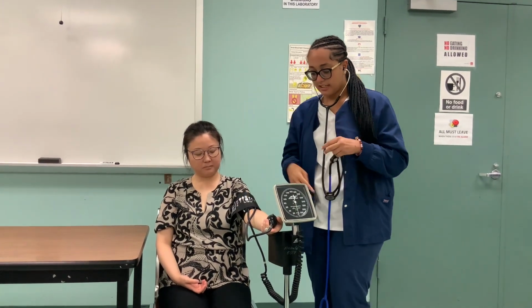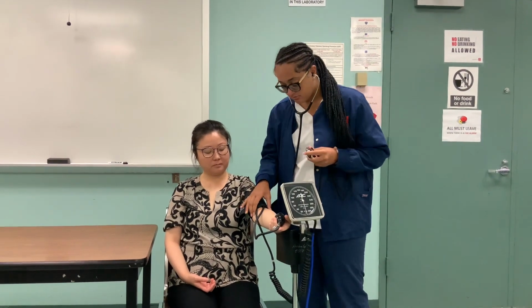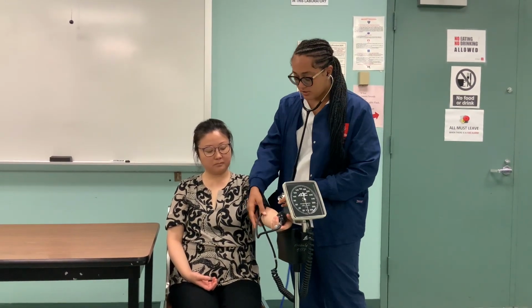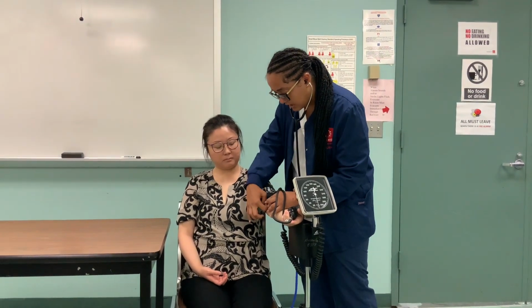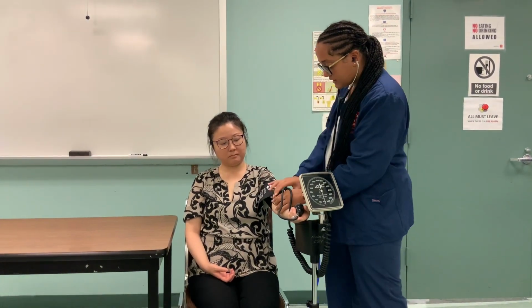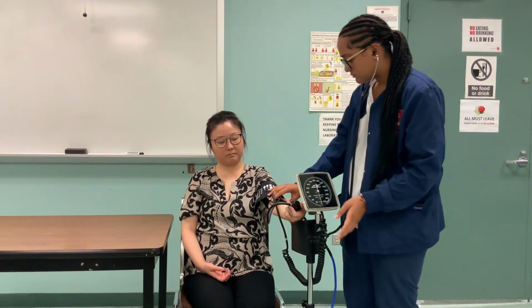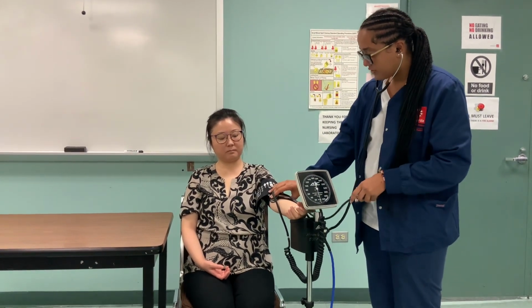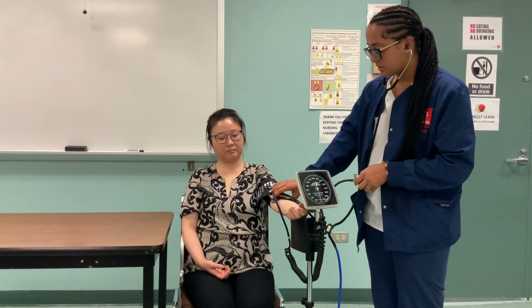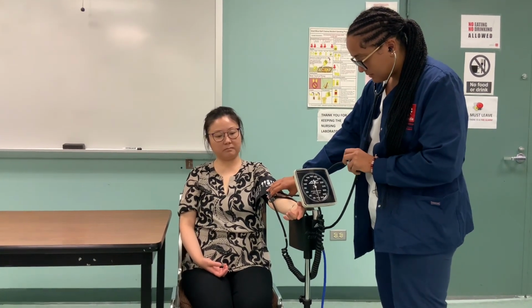So I would put it here, and like I said, you wanna palpate the brachial so you know where to put it. So I knew that hers was here. So I would place that there, and then you would place your fingers on the bell of the stethoscope. And you wanna hold it firm, but not applying too much pressure. And then we'd be tightening the knob again.